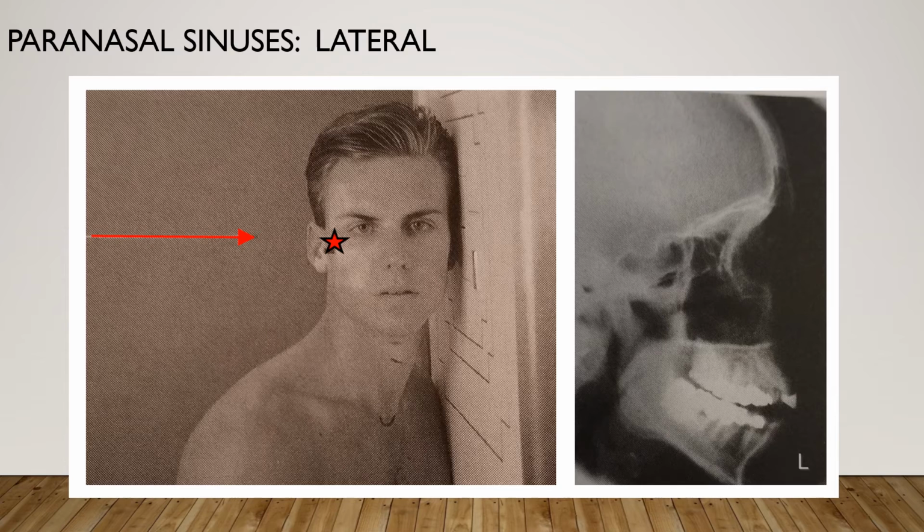There's no rotation or tilt, superimposition of the greater sphenoid wings, orbital roofs, and sella turcica, optimal density or brightness and contrast to visualize the paranasal sinuses, and sharp, bony margins with soft tissue detail and no motion.